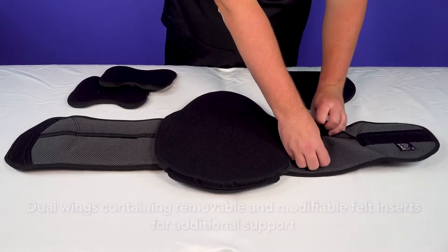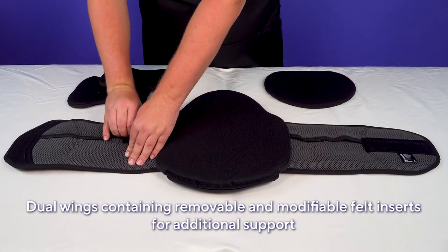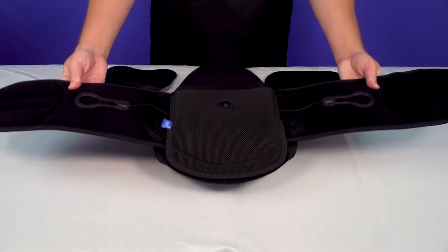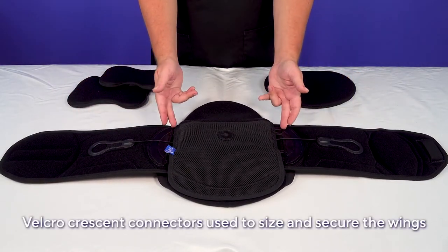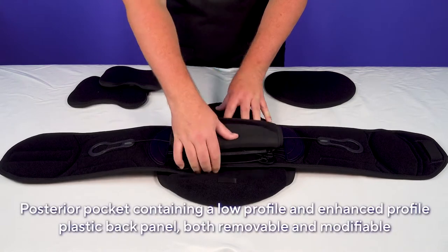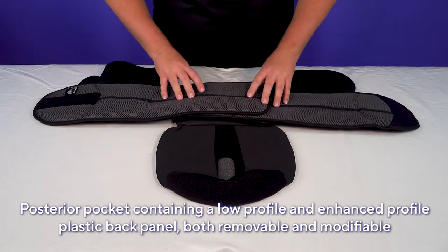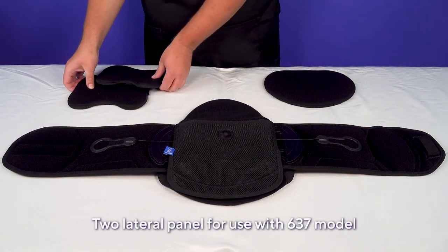Dual wings containing removable and modifiable firm felt inserts for additional support. Velcro crescent connectors used to size and secure the wings, and dual pull tabs to tighten the brace. A posterior pocket contains a low-profile and an enhanced-profile plastic back panel — both removable and interchangeable. Finally, two lateral panels for use with the 637 model.